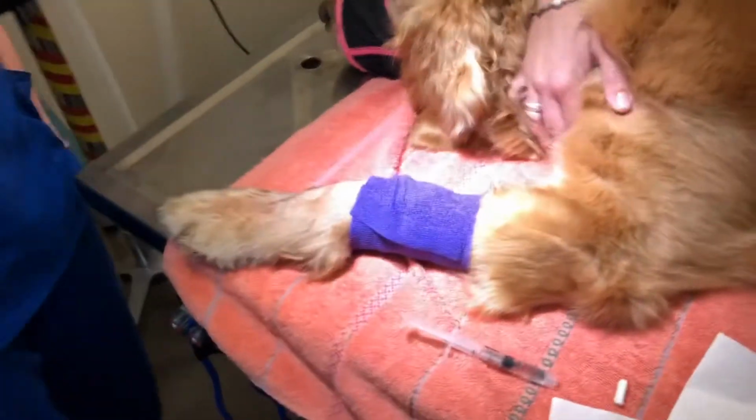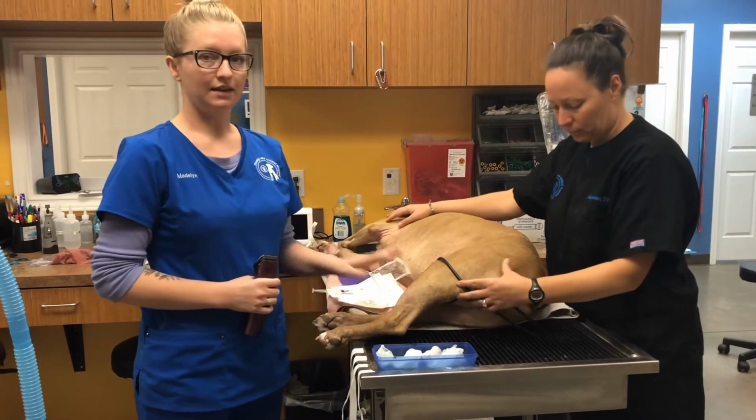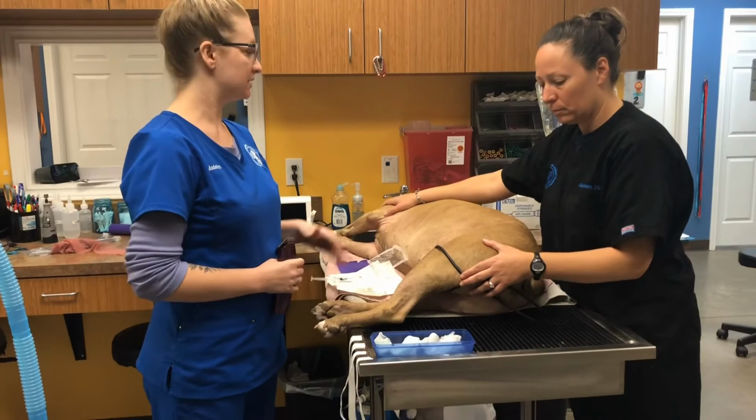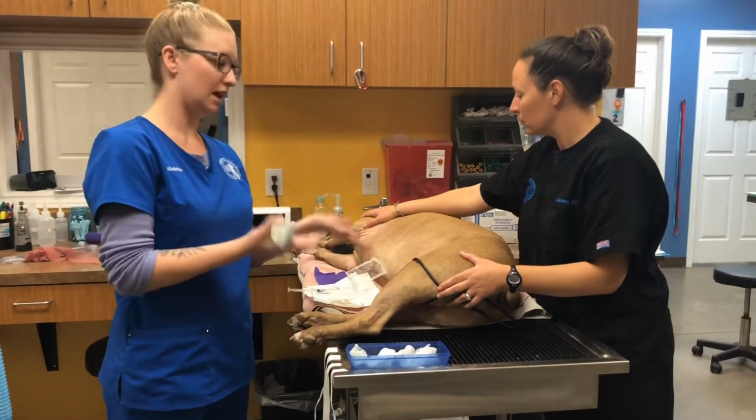And that's it. Okay, now I will be demonstrating the placement of an IV catheter in a lateral saphenous vein of a canine patient. This is our patient. She's been sedated. She's ready to be anesthetized, so she's in lateral recumbency.